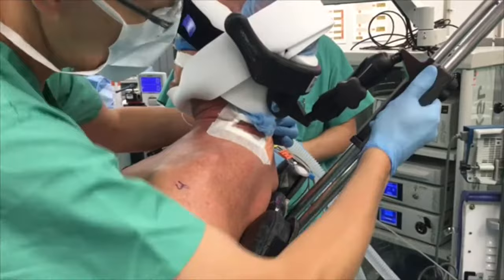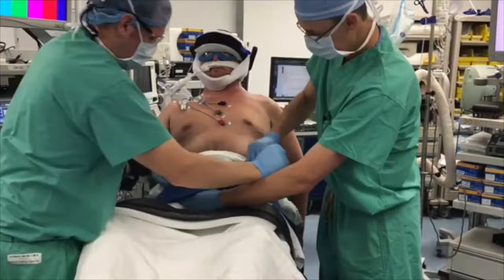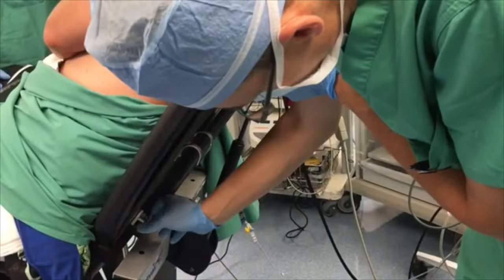The contralateral extremity is then placed on an Arthrex padded arm holder while assuring the wrist remains in a neutral position. A seat belt is placed over the patient's legs with foam padding between the belt and legs, with a further strap being placed across the abdomen with foam padding between the patient and the belt for protection from irritation of the strap.